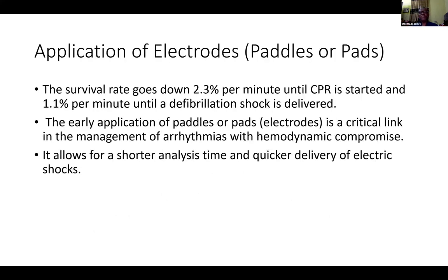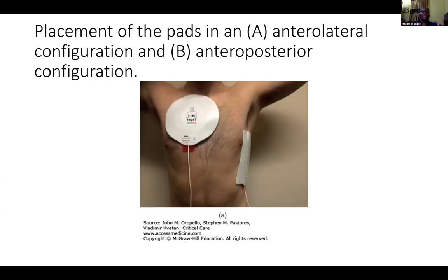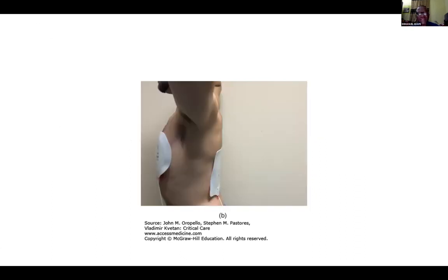So apply your paddles, apply them appropriately. There are two recommendations. One recommendation is that you place them anterior-lateral. The second recommendation is anterior-posterior. This one is the anterior-posterior placement. This is recommended for those that have ICDs or devices, the guideline recommends this. Or for those that are pregnant, the guideline also recommends this.